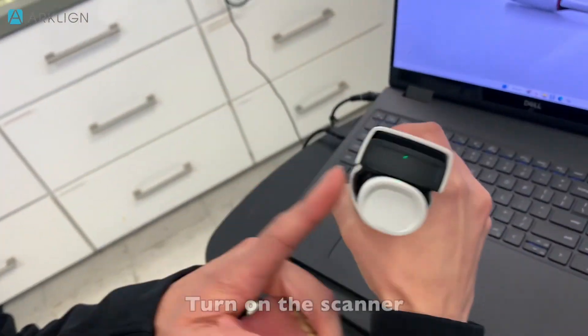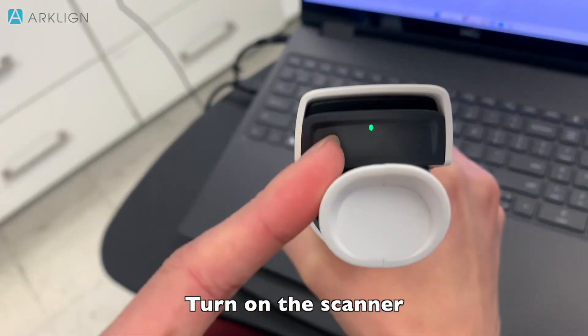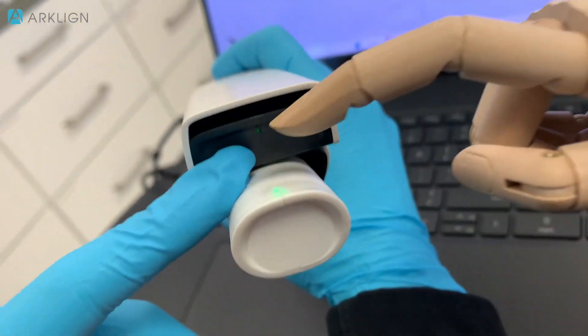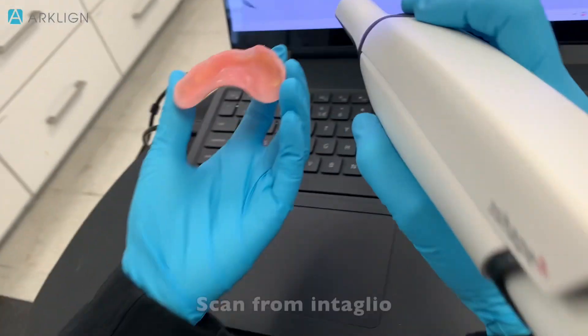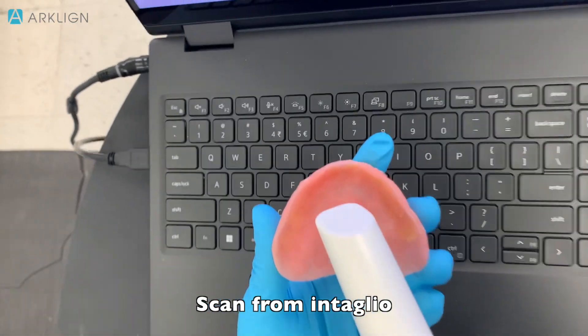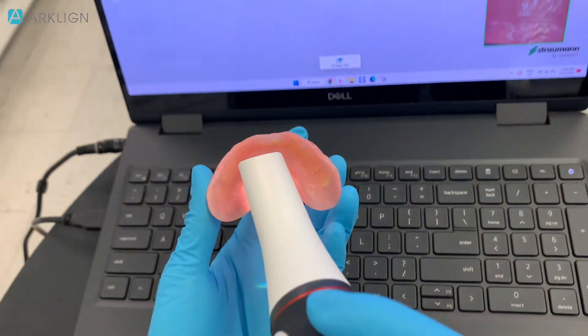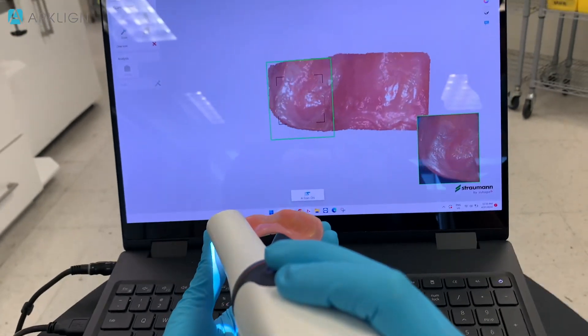Make sure your scanner is on — there's a green light right there. Make sure the scanner is on. I find it is more successful to scan from the intaglio surface first. I'm going to turn on the scanner and then we're going to start capturing all the intaglio surface first.